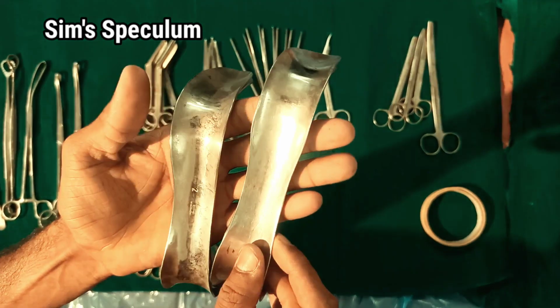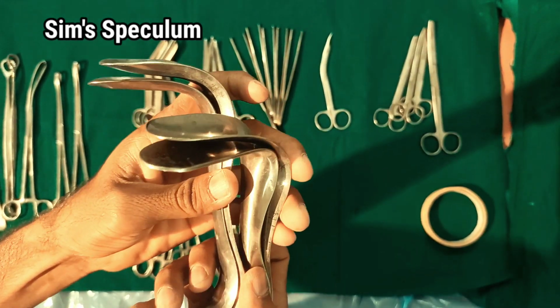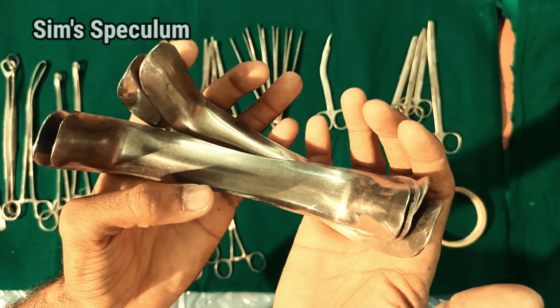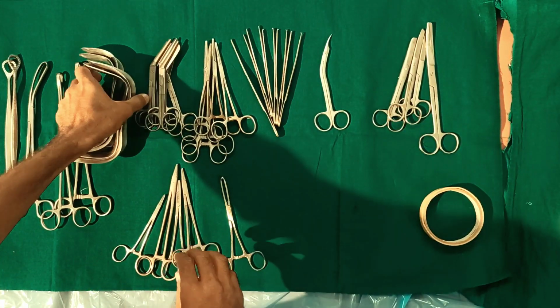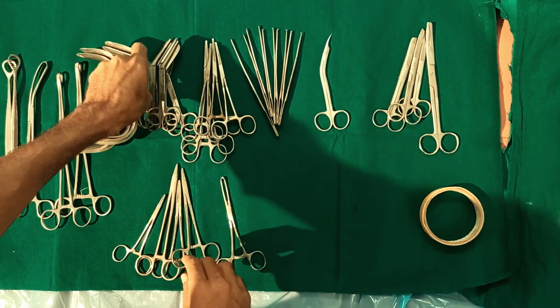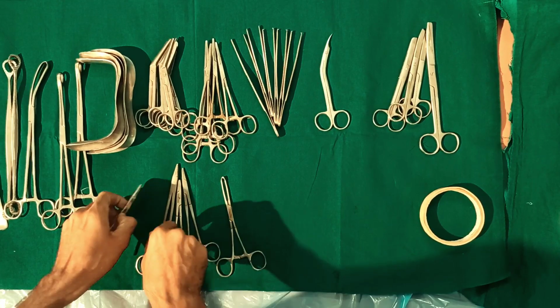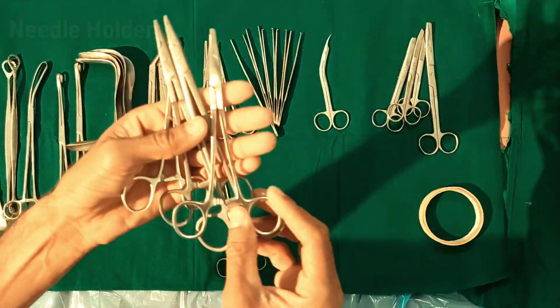The disadvantage of Sims speculum is that it is not self-retaining. The examiner might want to use an anterior wall retractor in addition to Sims speculum for better visualization of the cervix. A needle holder.